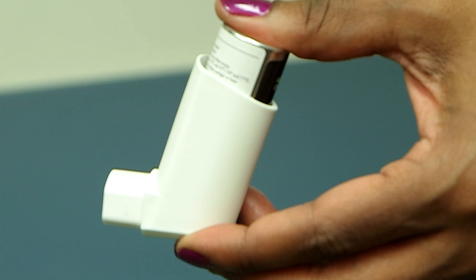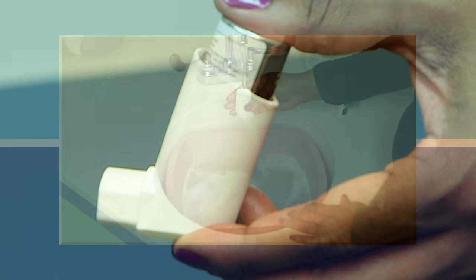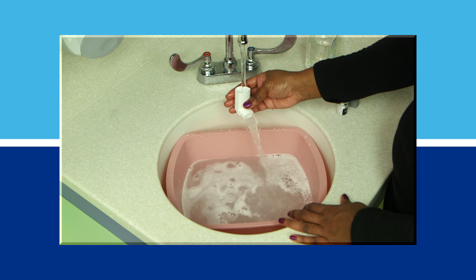It's important that you clean your inhaler once a week, or more if your doctor or nurse recommends it. Follow these steps to clean your inhaler.